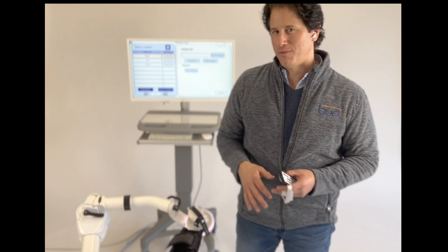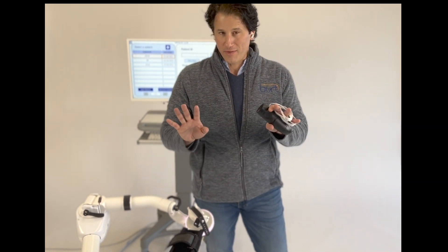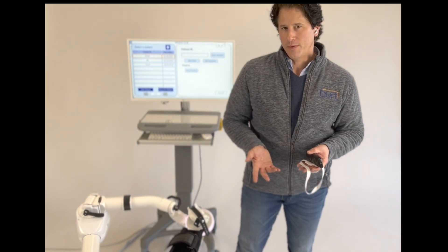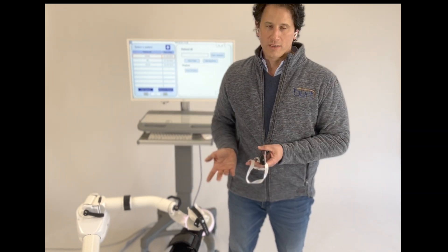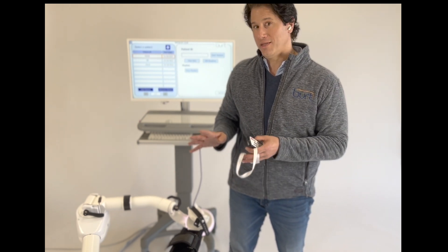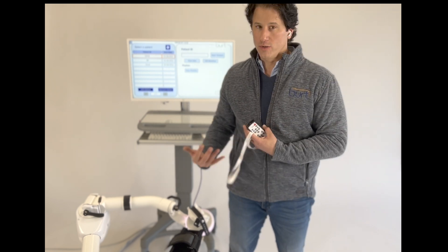The purpose of this video is to provide an overview of Burt. This is intended for people in facilities that want to have a demo or have scheduled a demo of Burt, because we want you to have an idea of what it does so you can start thinking about which patients you want to use with the machine.